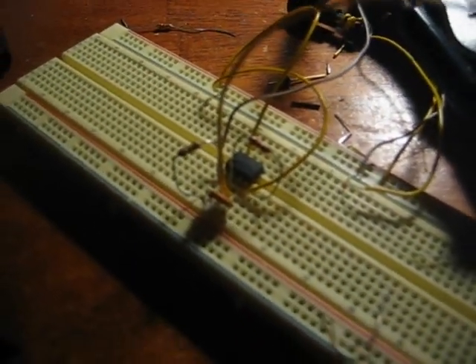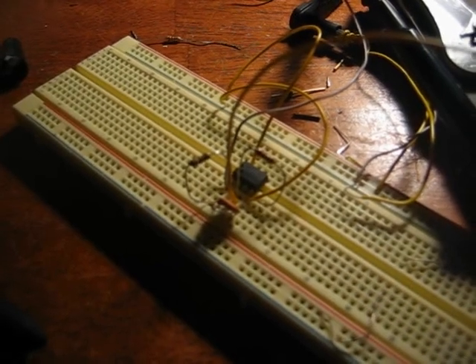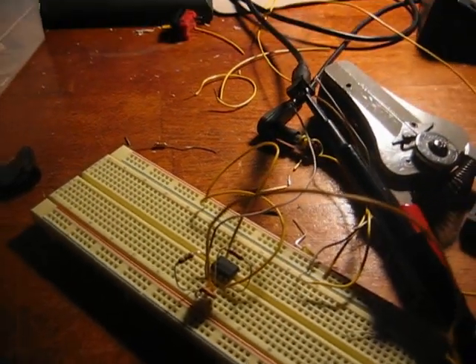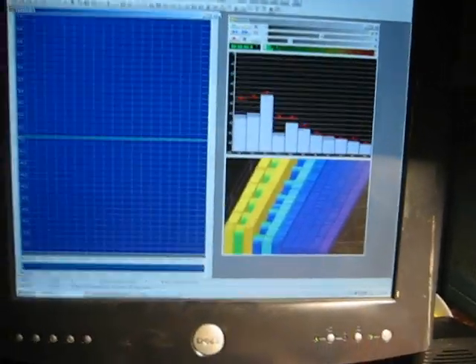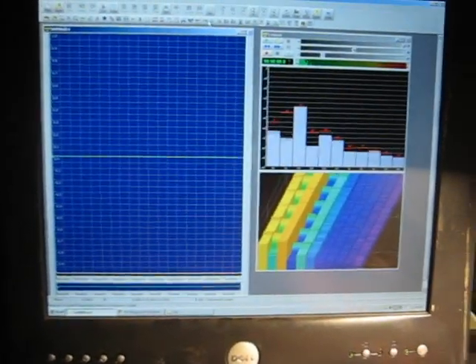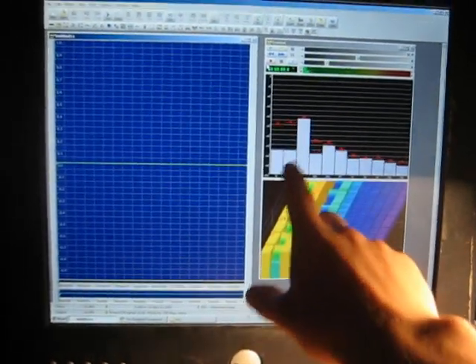They go into this small circuit here. It's pretty simple. We have an operational amplifier, a few resistors, and a capacitor. The main purpose of the capacitor is to reduce the amount of electrical noise we get. And also, I found that as I hooked up myself to the oscilloscope or to the amplification circuit, my body actually acts as an antenna for a radio station, and I kept hearing this Spanish radio station. So I added the capacitor. Now we only get these low frequency components coming through.